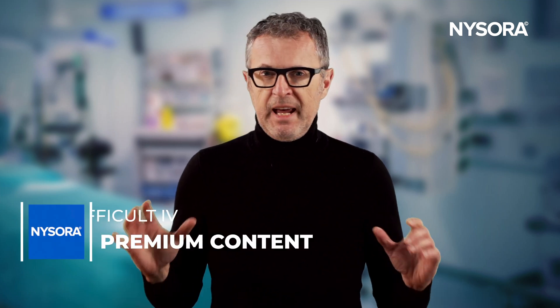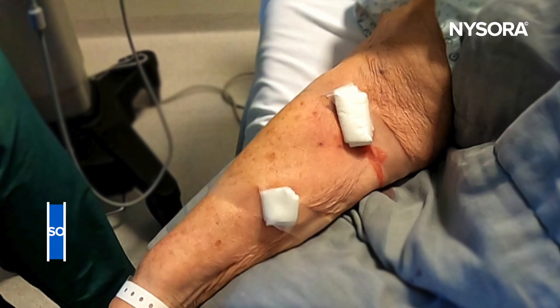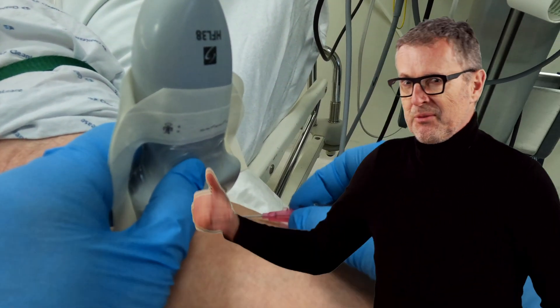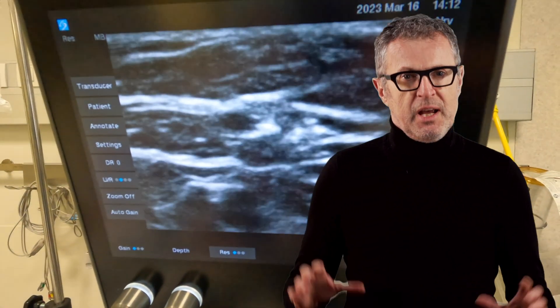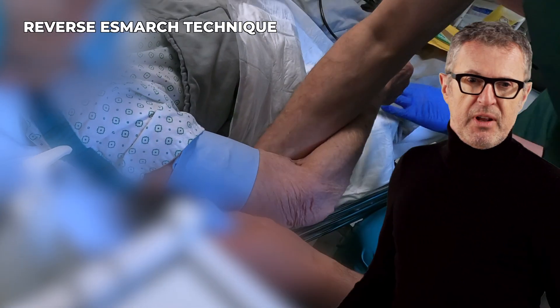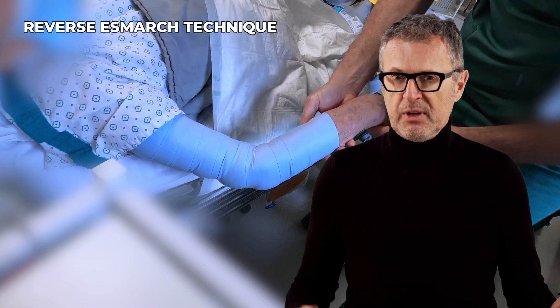In this video I will demonstrate a technique for IV access in a patient in whom several previous attempts by different personnel failed. While we could use an ultrasound to insert a central venous catheter or a deeper seated IV such as a brachial vein, we wanted to demonstrate that a simple technique using an Esmarch can be very effective for peripheral venous access in most patients with difficult veins.